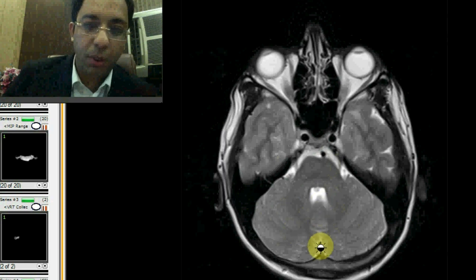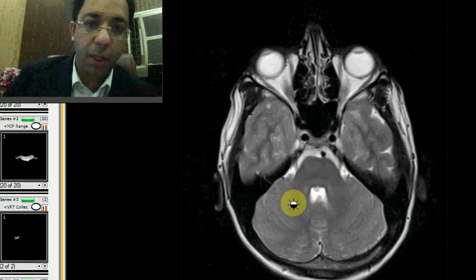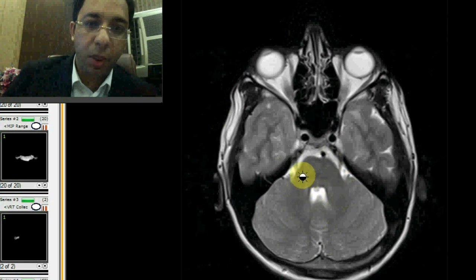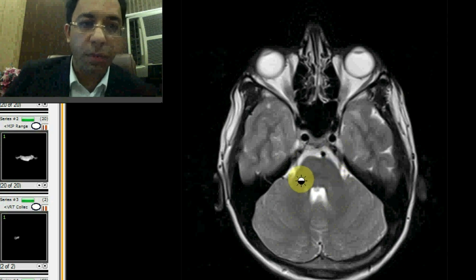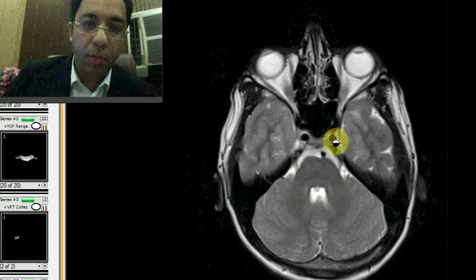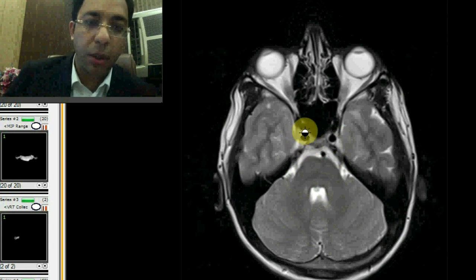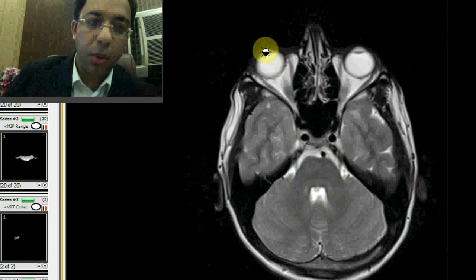As I go up, this is the cerebellar vermis, the middle cerebellar peduncle, and you can see the pons. If you take a careful look, you can appreciate the fifth nerve arising from the root entry zone from the pons. You can now see flow voids here, which are the internal carotid artery flow voids — this is the cavernous part of the internal carotid artery.